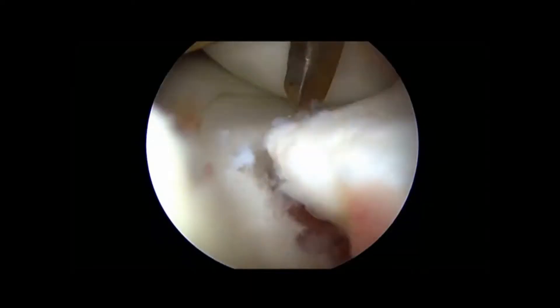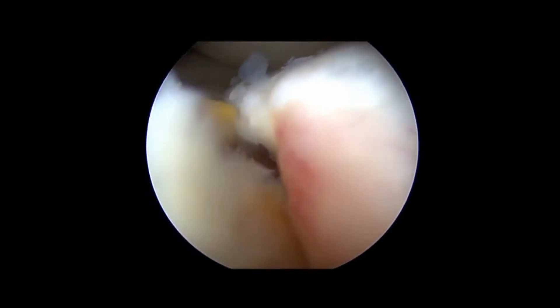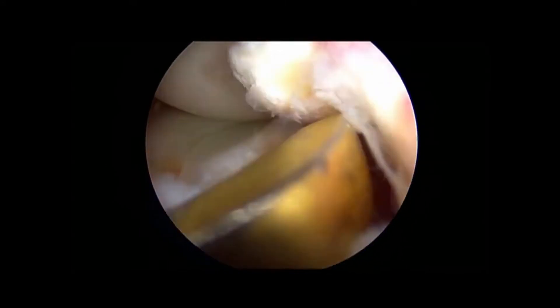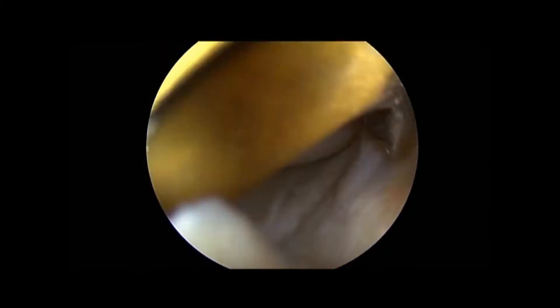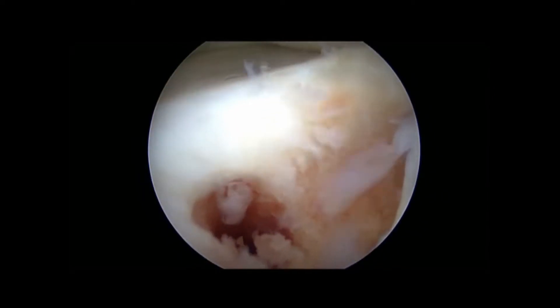Passing suture into the knee. First, localize the fracture and clean up the space for better healing. Drill a hole and turn the burr around.